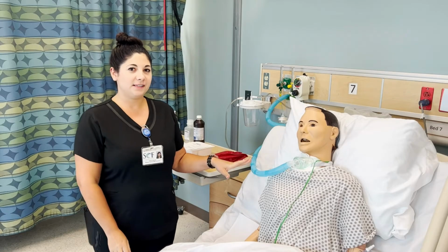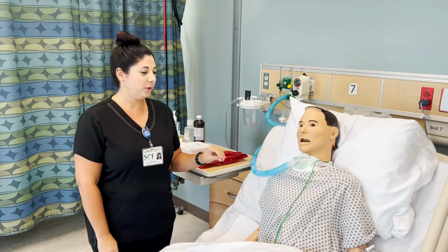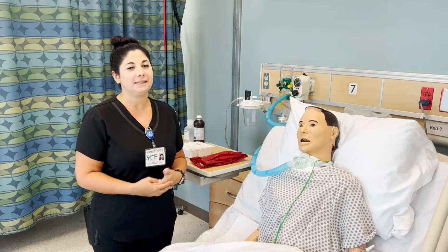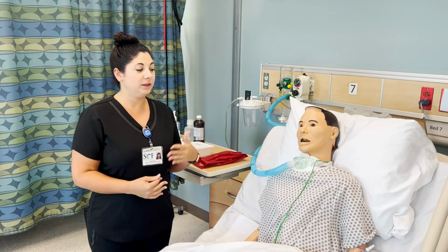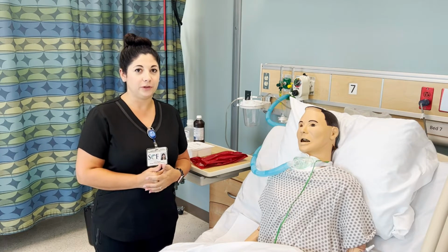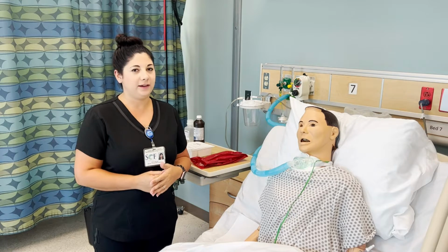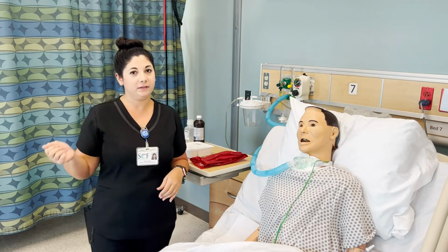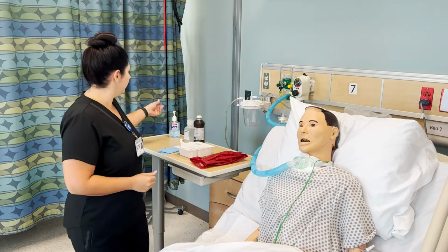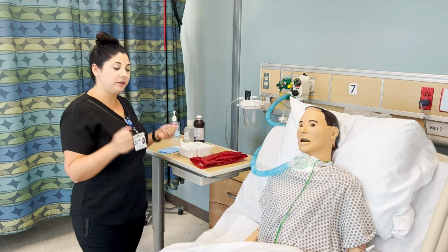We have already suctioned our trach patient, so now we are going to clean the stoma and replace the dressing. You don't want to clean before you do suctioning because it's just going to get dirty while you're suctioning. So make sure you're doing it after. So I have knocked on the door, I've introduced myself, I've explained to my patient what we're doing, washed my hands, and provided for privacy.